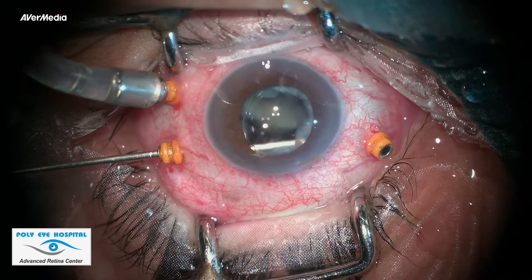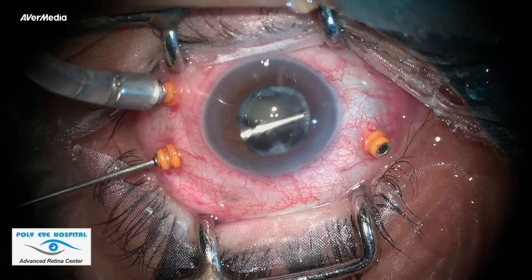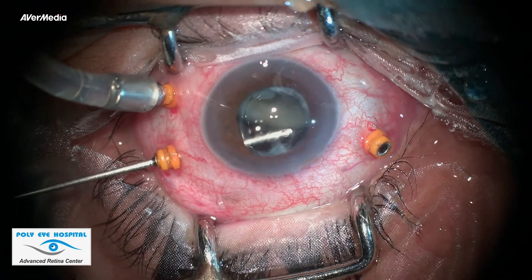This video is to describe the technique of emulsifying hard nucleus in the vitreous cavity using a 23-gauge cutter.